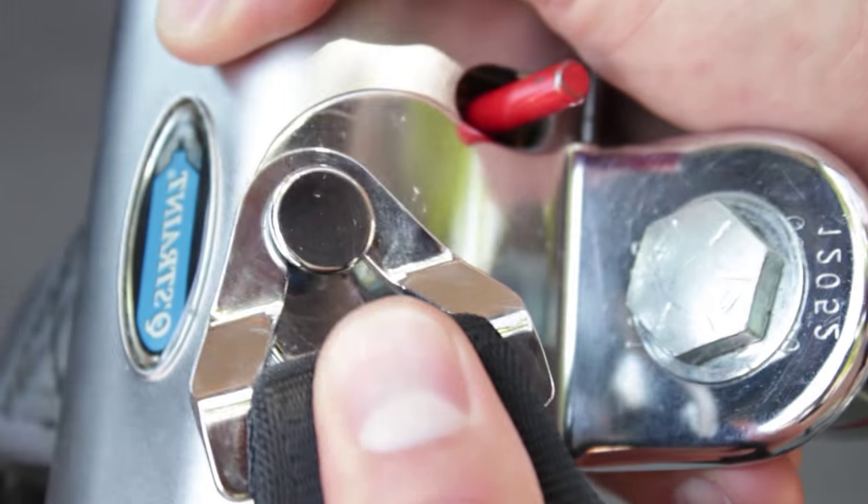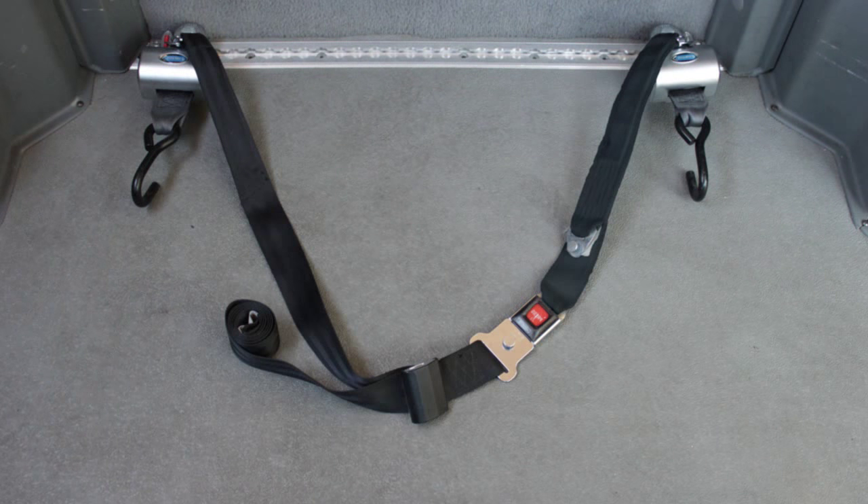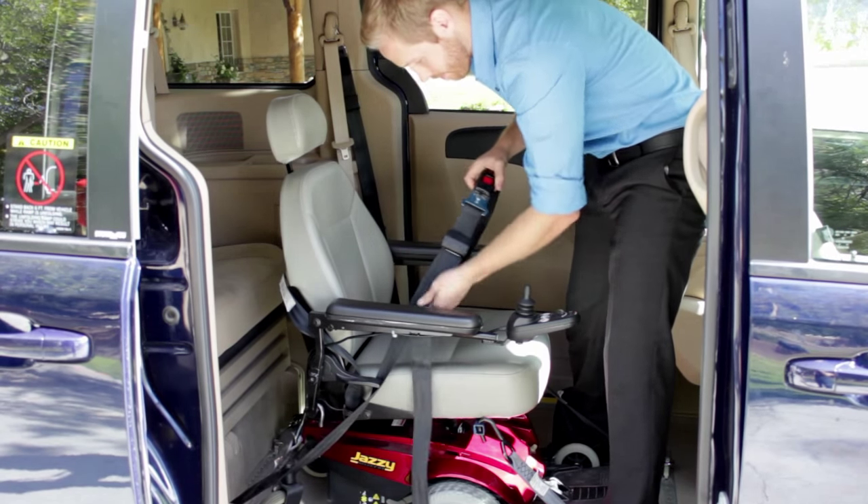The seat belt straps should be attached to the tie-downs that will be at the rear of the wheelchair. When you connect the seat belt, there should be enough room to go through the armrest of the wheelchair and around the occupant's waist.